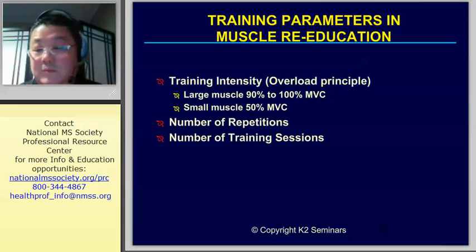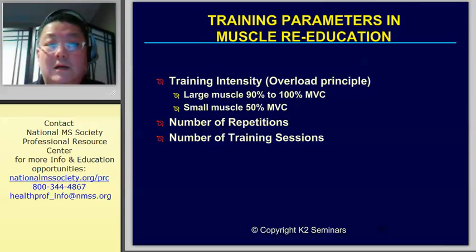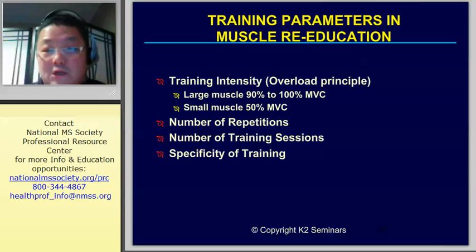Number of repetitions becomes important. Can you get an outcome with overloading the muscle with 10 repetitions? And the answer is absolutely yes. Can we get the number of training sessions down to 1, potentially, and another revisit, so that they can come in, get the training, get the unit, go home and do it themselves and get the outcome?